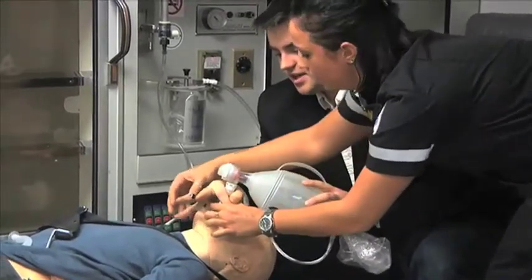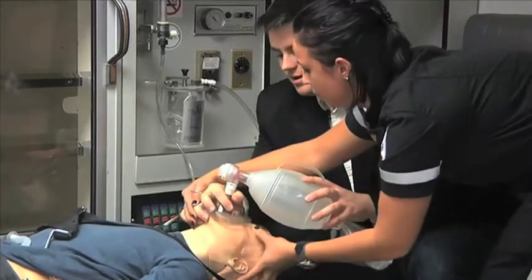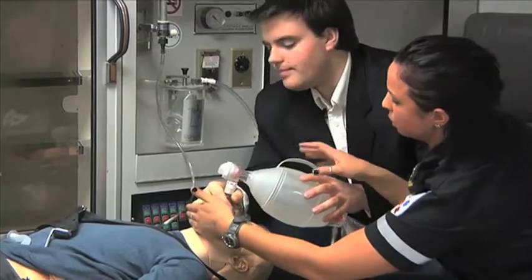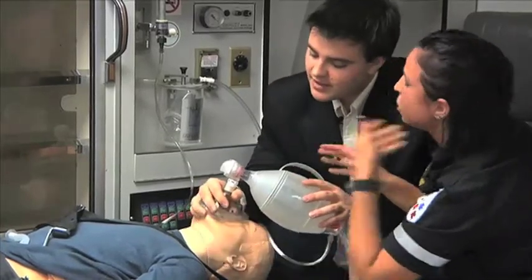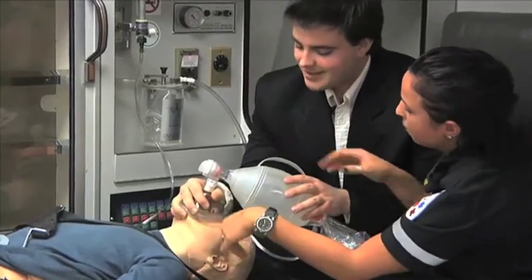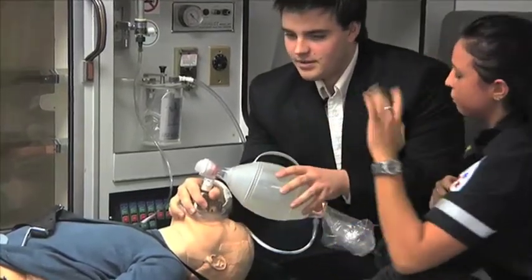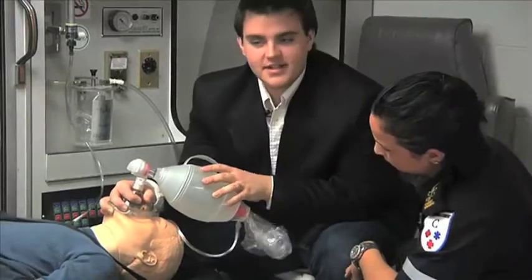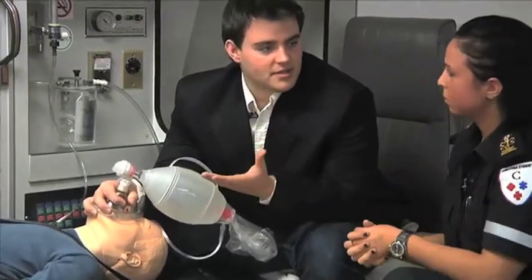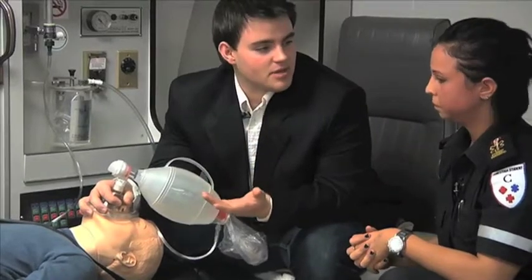Okay, so C here? Yep. Fingers under the chin, and you need to make sure the airway is open in order for the air to get in. So you need to pull your fingers up a bit to keep the chin up like this. Yep. Then what you need to do is give one breath every 5 seconds. So then this is giving oxygen to the patient and helping them breathe so that you can get them to the hospital in time for them to get proper treatment.